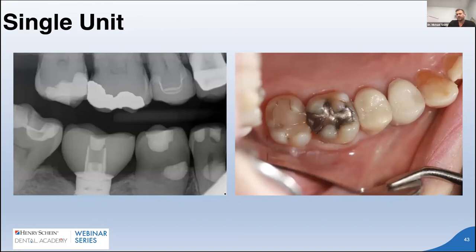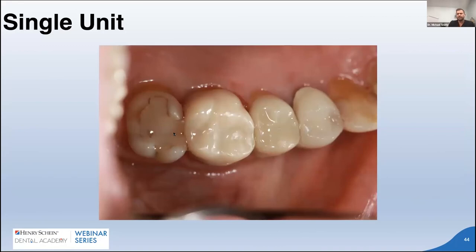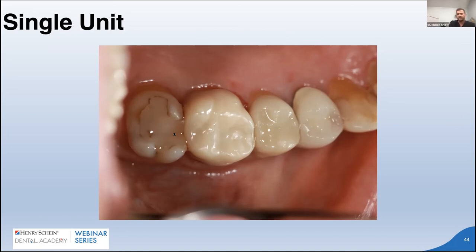Clinical case: standard hygiene presentation with a failing amalgam on #3 with recurrent distal decay, an older composite on #2, an LT Emax on #4, and a PFM on #5. After conservative prep and cleanup, 3M zirconia was delivered. The vitality of the zirconia is right on par with the LT Emax next door - not opaque like older 3Y high-strength zirconias. The translucency looks nice in the posterior and more vital than the adjacent PFM. Very comfortable using 3M zirconia in premolar and molar areas.